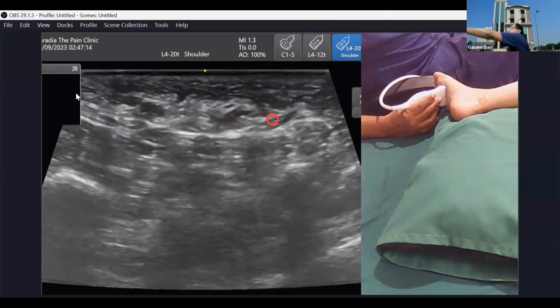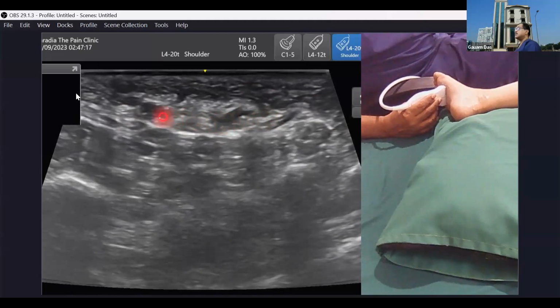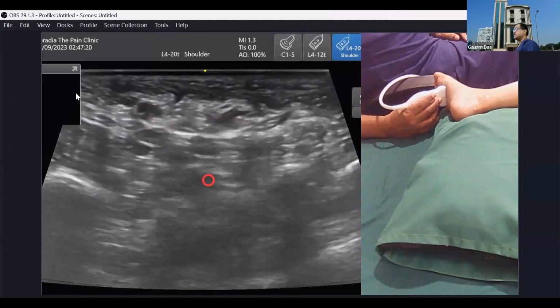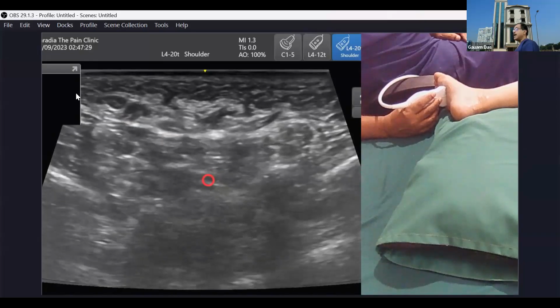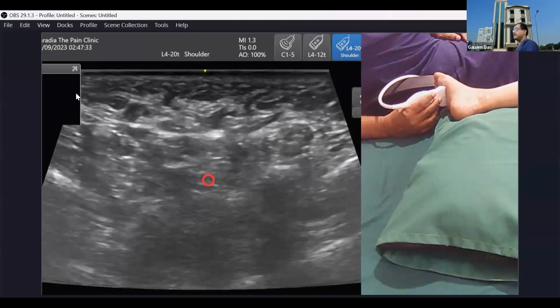And in between these black areas, like you have seen in the hand, these are the lumbricals. So these are the lumbricals muscles. After that layer, which muscles are we having? We are having the adductor muscles. Adductor and the flexor muscles.